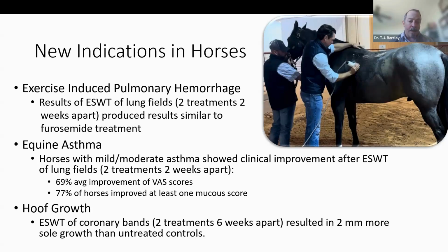And then another very new indication is the effects of shockwave on hoof growth. A recent pilot study showed that two shockwave treatments performed 6 weeks apart, in other words at trimming intervals, resulted in 2 millimeters more sole growth per interval in those treated horses than the control group.